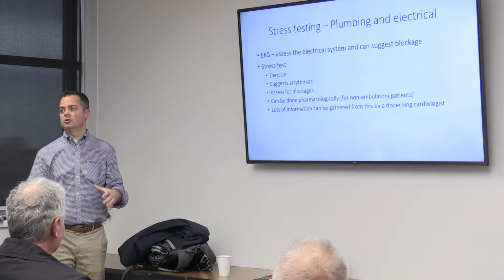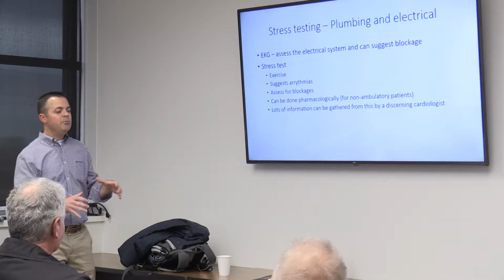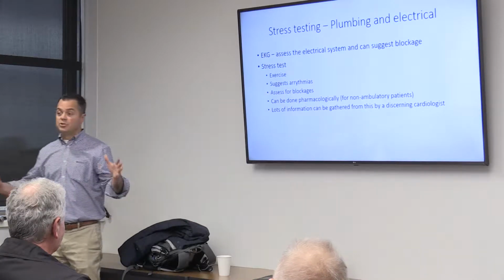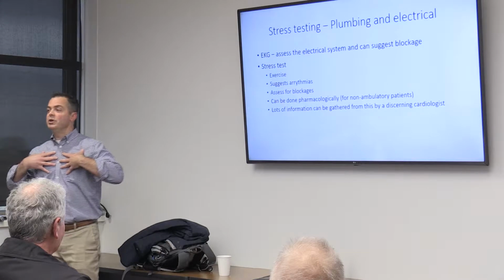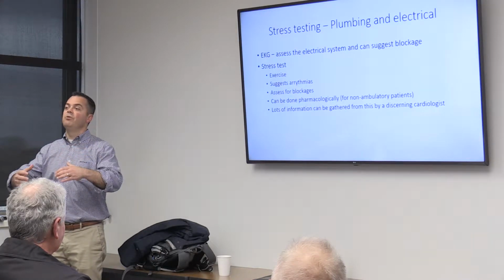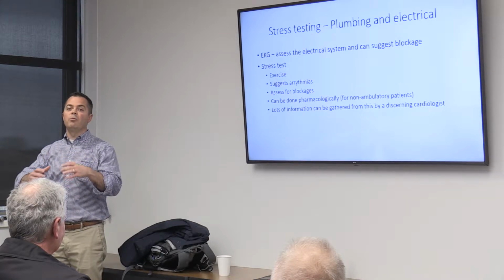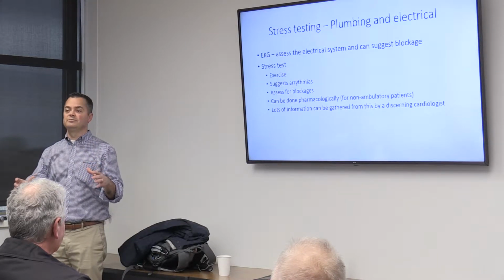Now this test can be done alone with just a treadmill. We just walk you and see how far you go, keep you on an EKG, and see what happens. That is a very useful and important test in my world. Okay? It doesn't pay a lot of money, but it's a very, very useful test, and there, like I said, is a lot of information there.